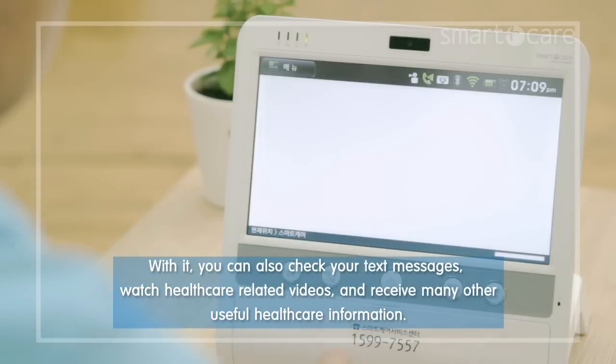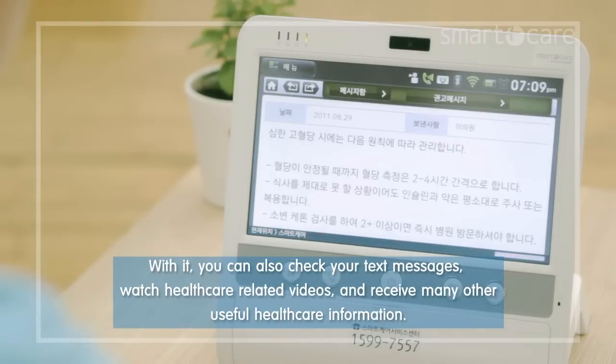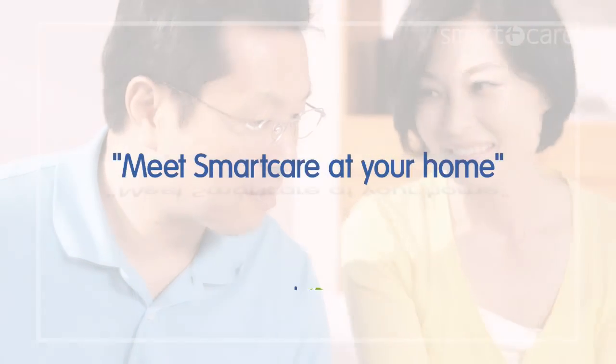With it, you can also check your text messages, watch health care related videos, and receive many other useful health care information. Meet smart care at your home.